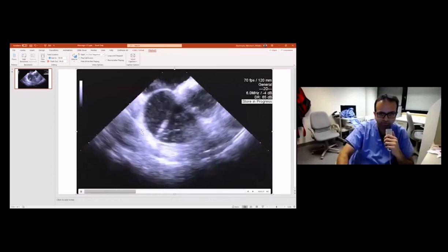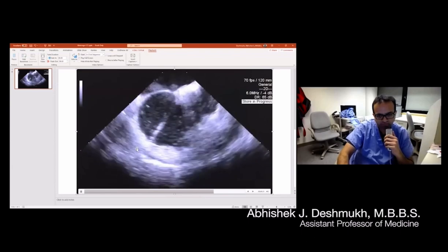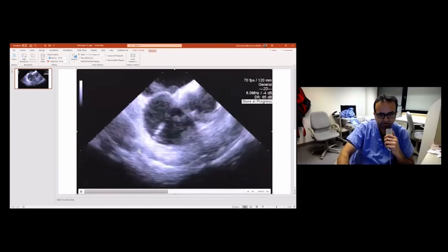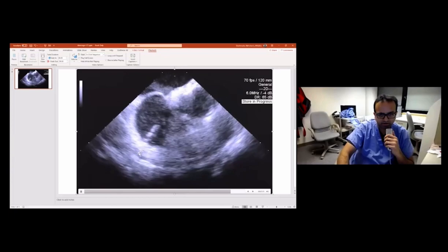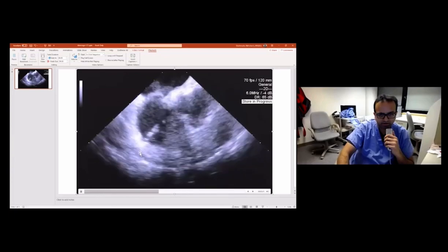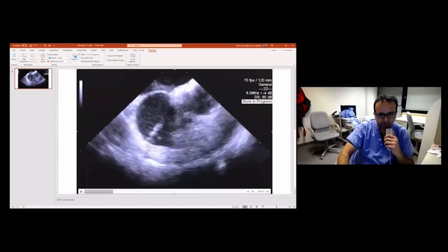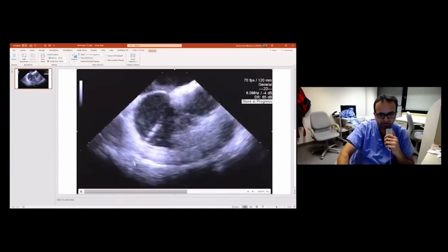Okay, so this is the left atrium transeptal puncture. Now we are doing a mitral isthmus line connecting the left inferior pulmonary vein to the mitral annulus. And at least in this case, we went over it a couple of times and still it was not blocking. So we wanted to make sure, A, we are in good contact, our signal is changing, and whether we are making a good lesion based on intracardiac echo.